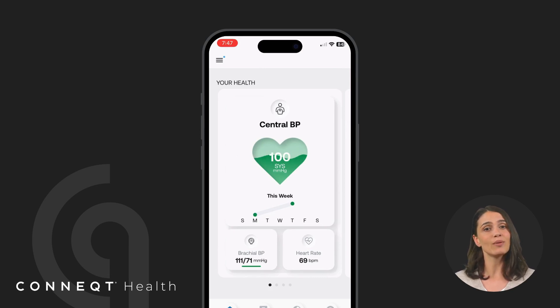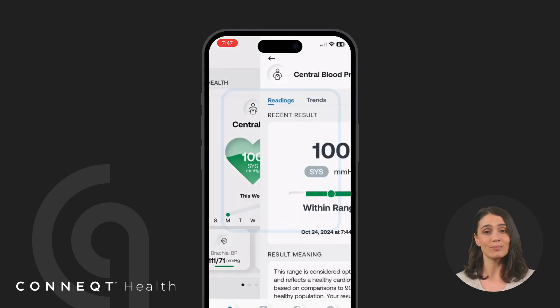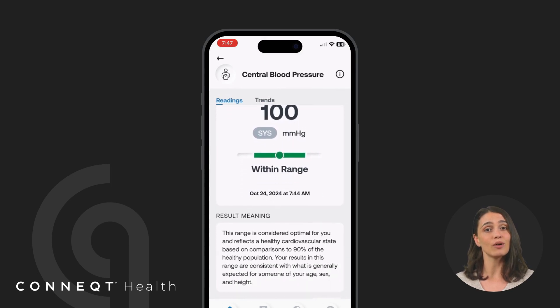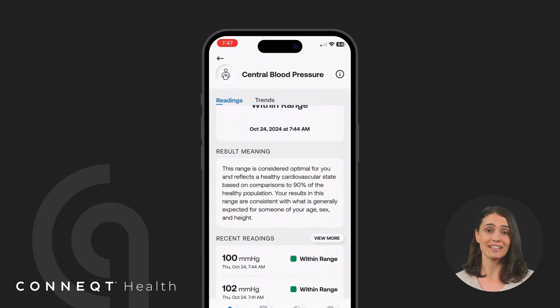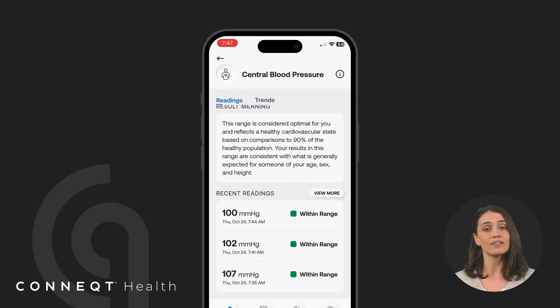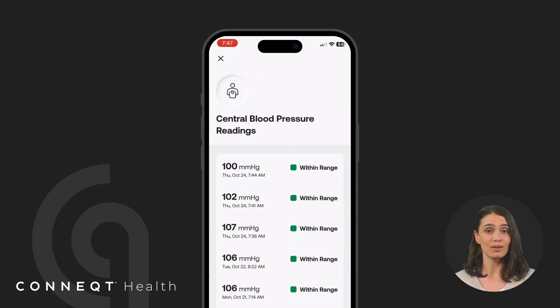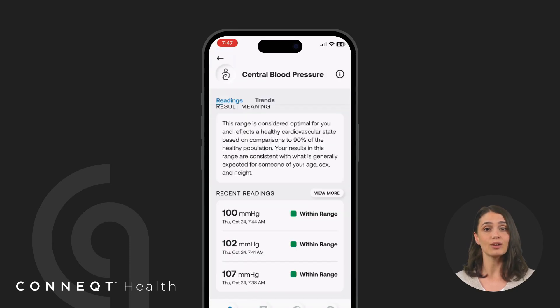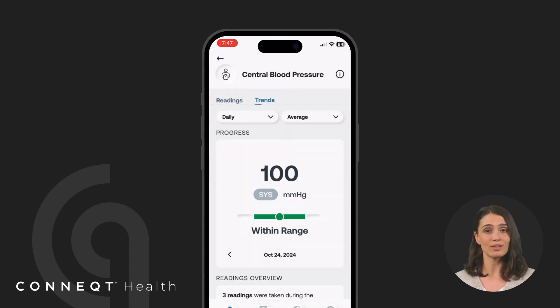To track your progress, select a parameter and scroll to the bottom of the Readings tab. Here you'll find the Recent Readings section. If you want to view all individual results from past readings, press View More.